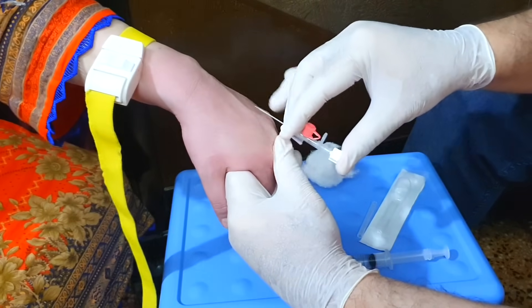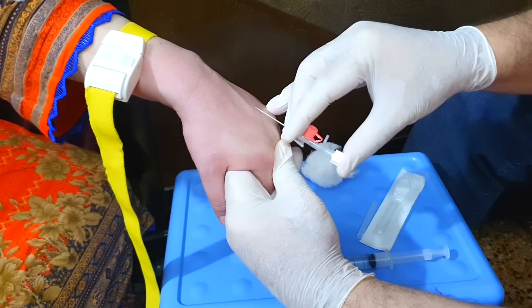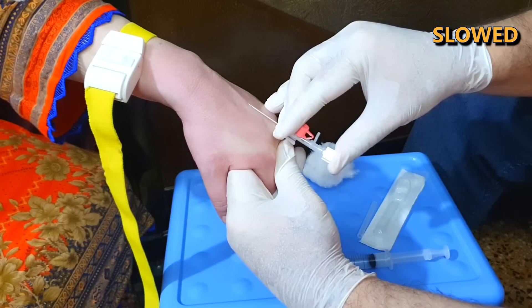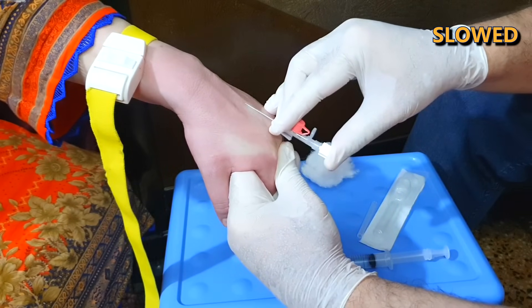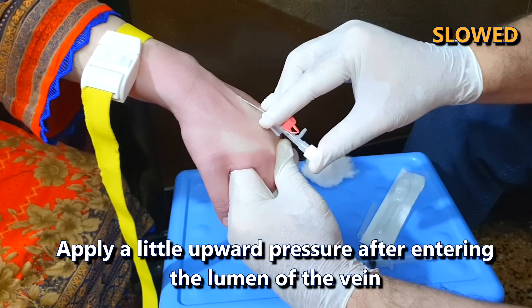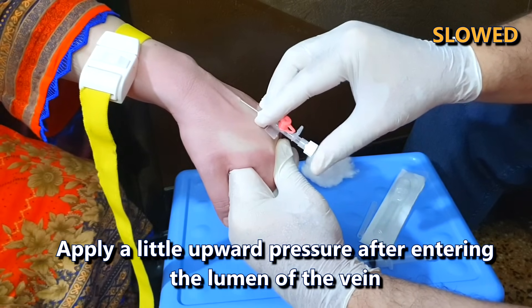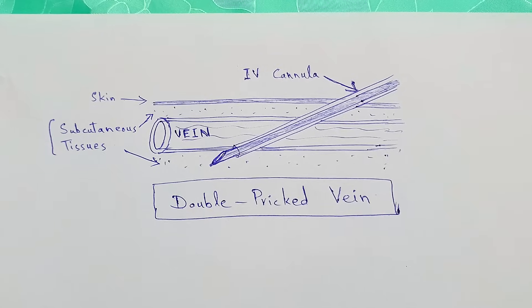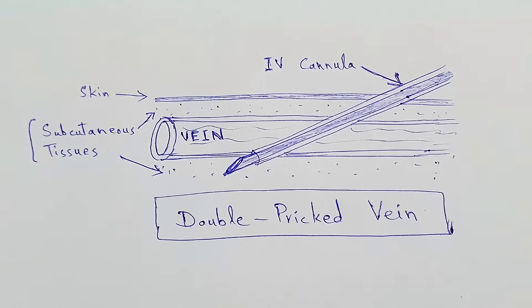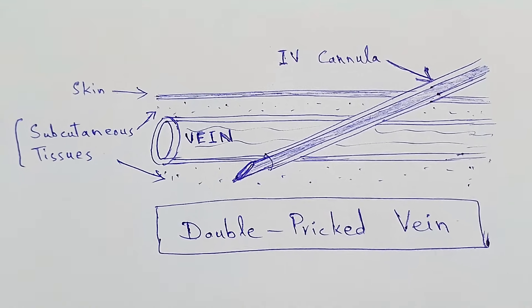Stabilize the desired vein by gently stretching the skin — this stabilization is necessary, however do not over-stretch the skin otherwise the lumen of the vein will collapse. Insert the cannula at a low angle of about 15 degrees. When the cannula is in the lumen of the vein, move it forward a few centimeters in the direction of the vein while applying upward pressure. This upward pressure is to ensure that the needle does not puncture the other side of the vein, which is called a double prick. A double prick causes hematoma or swelling at the site of cannulation, in which case you should immediately stop IV cannulation at that side.